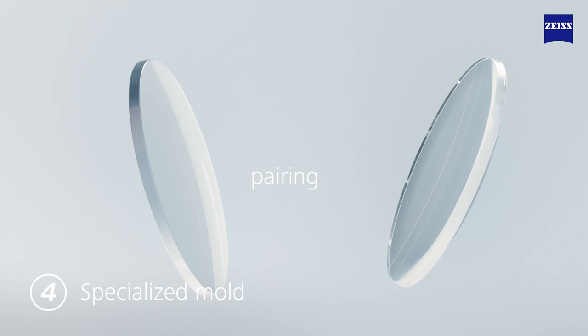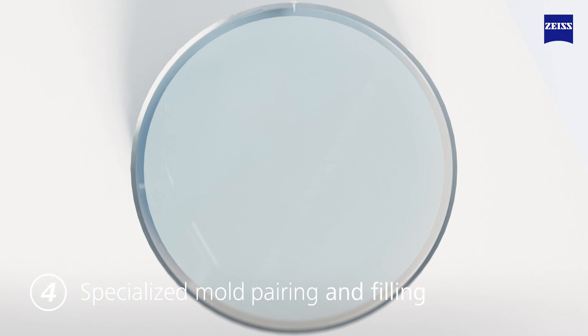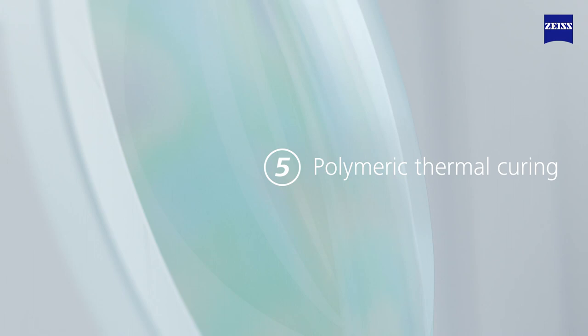Next, unique front and back molds are paired in different combinations for each prescription and SKU. It is then assembled and filled with Zeiss UV Protect or Blue Guard lens liquid monomer for the specific refractive index. Depending on the material, index, and prescription power, specific temperature profiles are followed to optimize the polymeric thermal curing. This is the next step to ensure that the optical shape is perfectly transferred from the mold to the final cast lens.